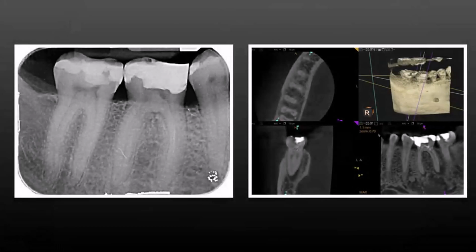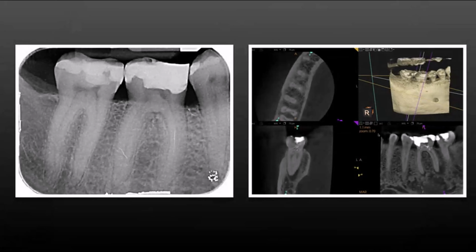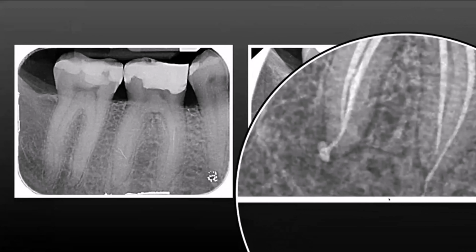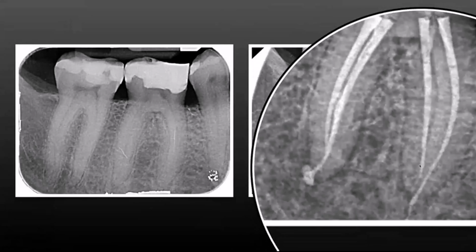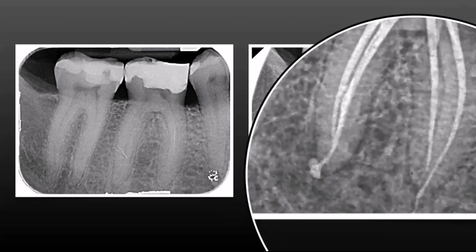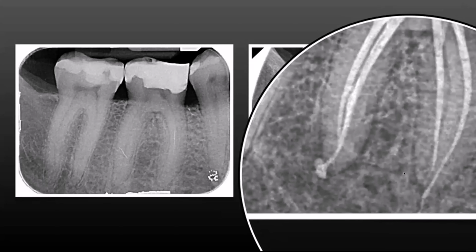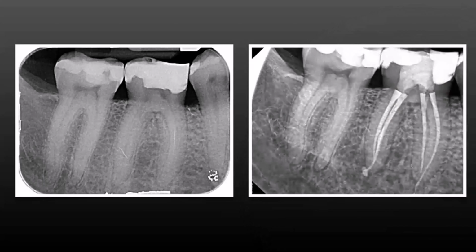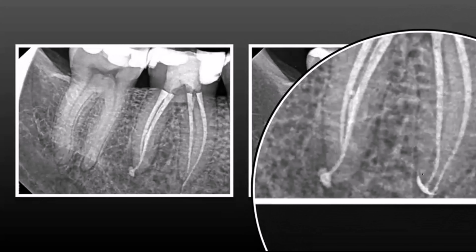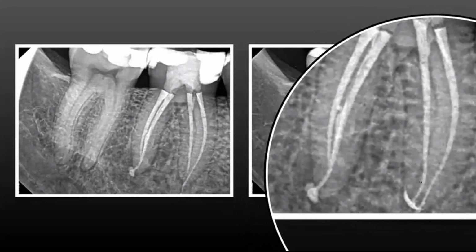This is just a standard case where I got a little bit unlucky on the obturation. So here's my final result. Doesn't look too bad, but when you look at it up close here, I didn't like this part here where my cone stopped there and I can see a little sealer tract. And most Gentlewavers will just leave that and let the sealer do the job, but it was bothering me. So it's just a quick repack. You can go in and pull the cone out and confirm, seat a new cone and be happy with the results. So that's what I did. It takes 10 minutes. So you just go back in and do it.